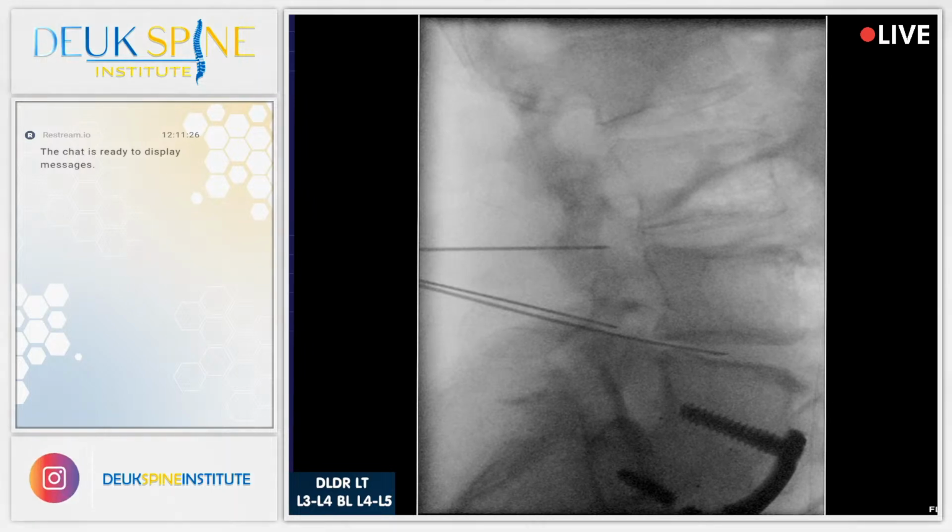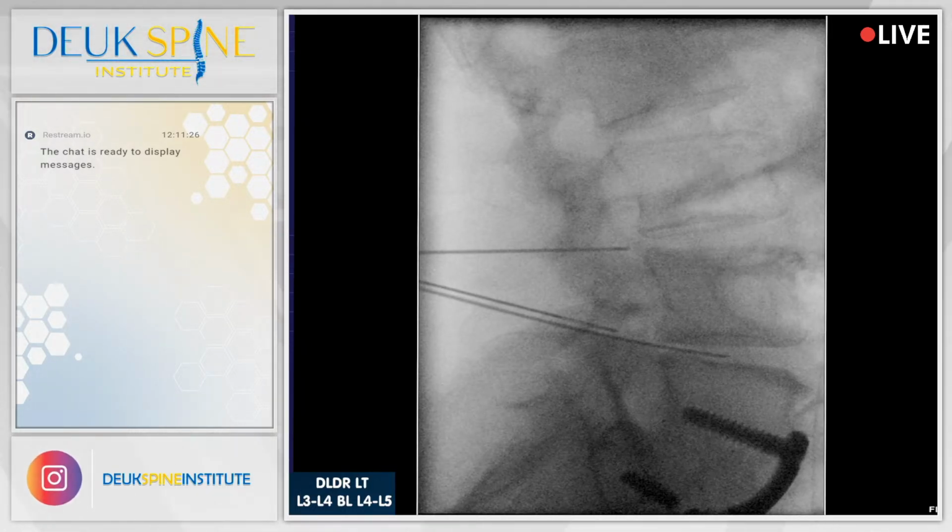Just caught right up, there it is. I'm caught up on the superior facet. You awake? My friend, you awake? Just lay still. I need you to not move, okay? It's Dr. Duke. Lay still.